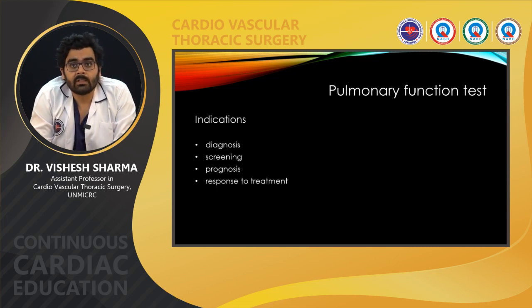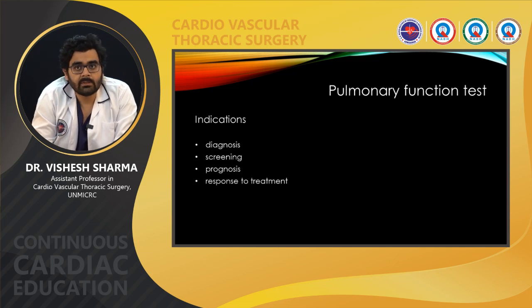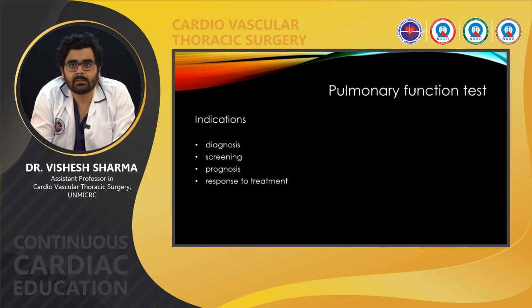It is also used to screen for early asymptomatic diseases or prognostication of patients with known diseases. It is also used to monitor response to treatments. However, symptomatic relief is the best measure to monitor response to treatments in respiratory ailments.